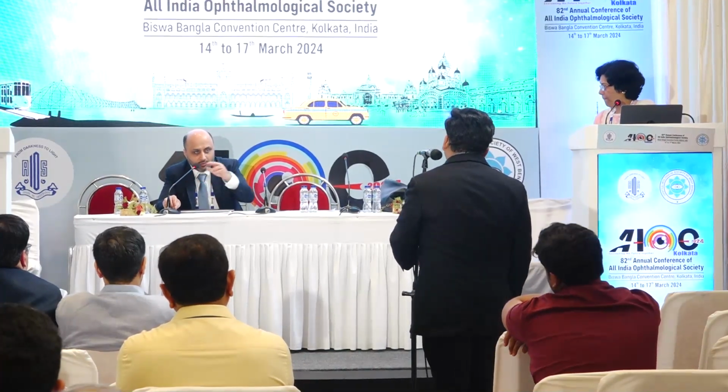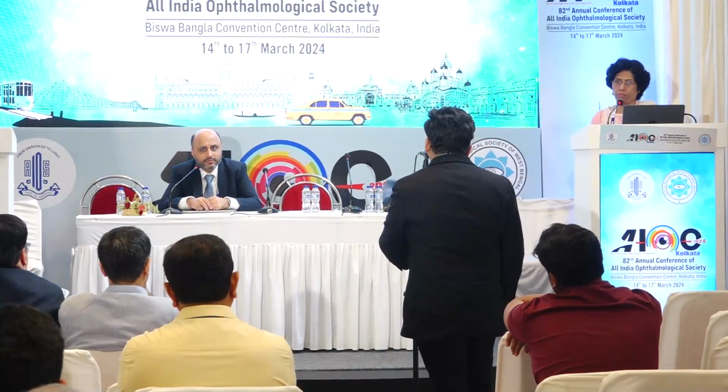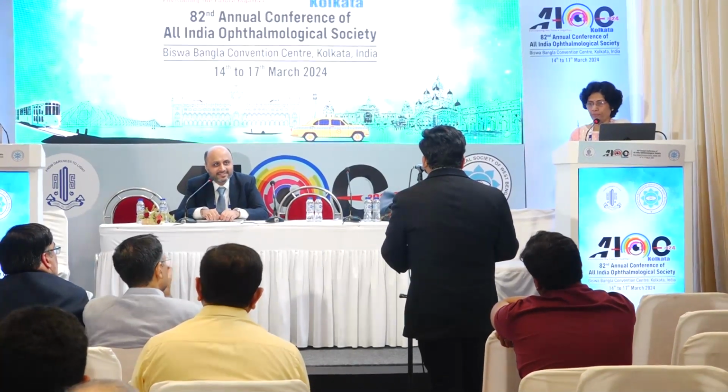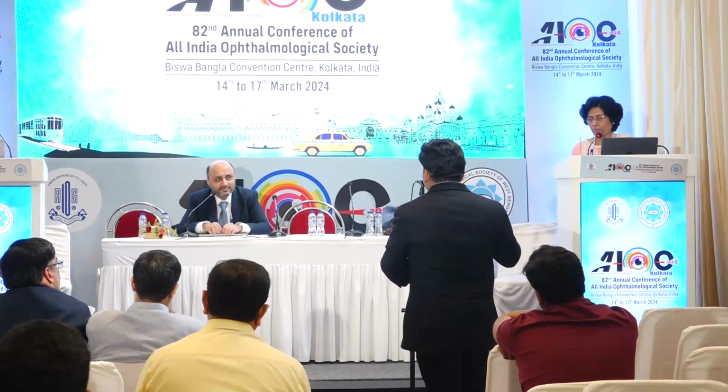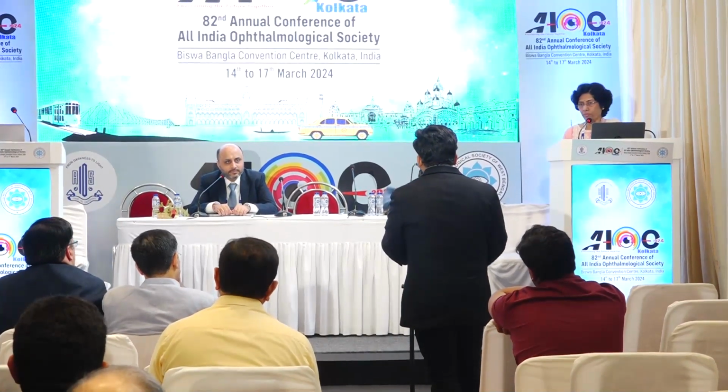And anybody using scleral buckles actually, or a belt buckle for that matter, just to support it? No, I know. Because initially I used to do it when I had just completed my fellowship, because of fear of all these redetachments. But I realized that the chances of anterior segment ischemia become very, very high, and the patient will come to you with recurrent vitreous cavity hemorrhages or neovascular glaucoma.